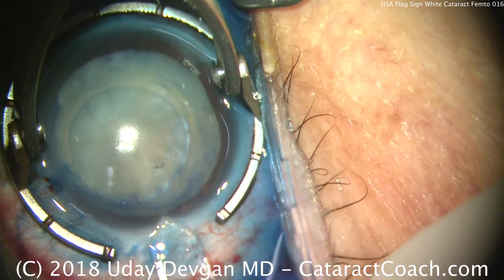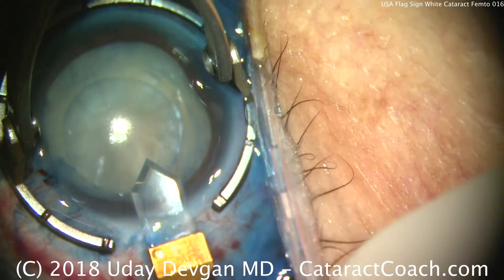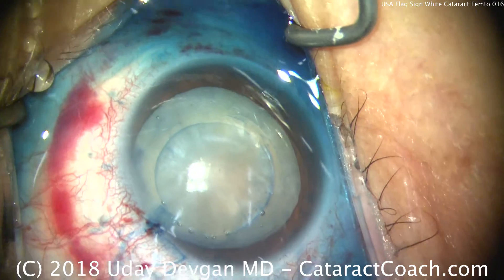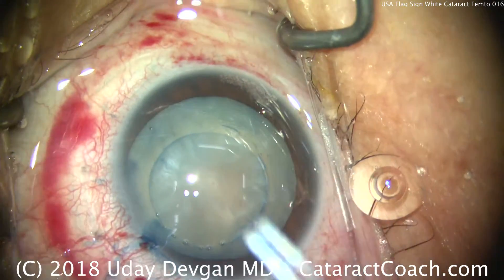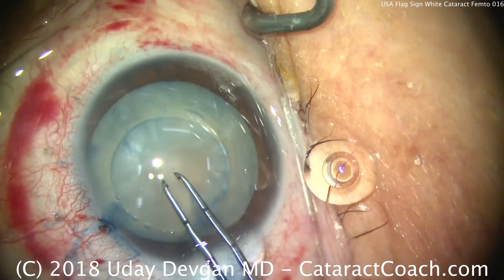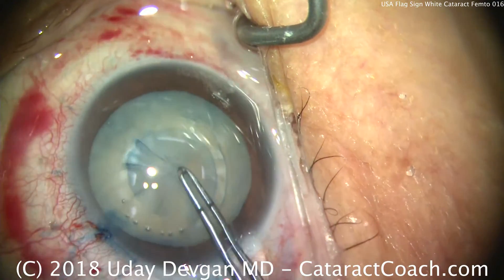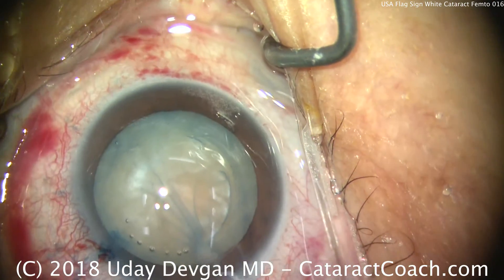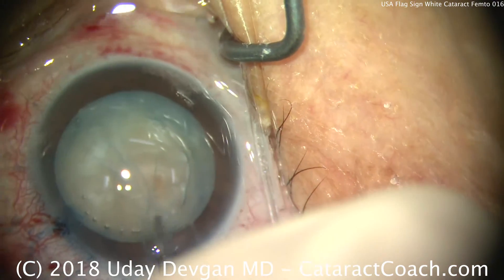By using the femtosecond laser to make our capsulotomy, we can do it in a closed eye without having an incision from the outside. That allows us to get a nice round capsulotomy in about one second with the laser without allowing any Argentinian flag sign. There's the central capsule just being pulled off, and you can see the laser has made a perfectly round and well-centered 5mm round capsulotomy.